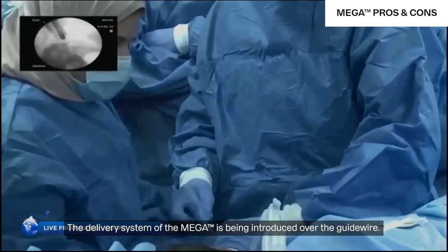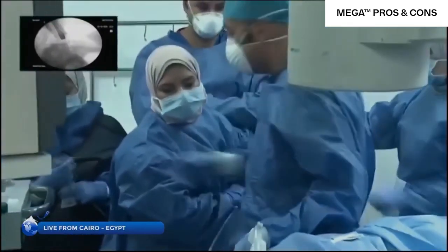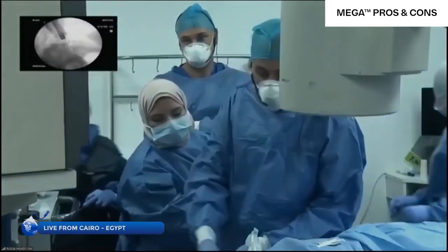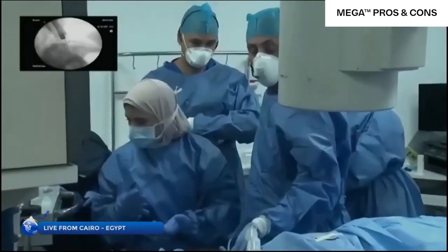One of the tips to keep the stent from migrating is to have a very big, very long part of it in the esophagus.